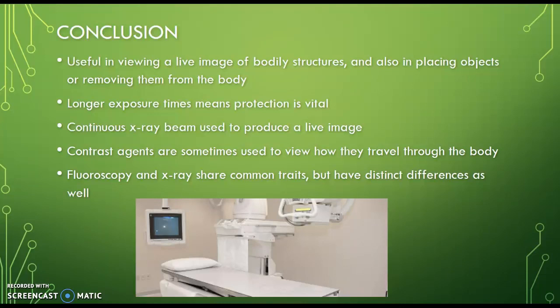Fluoroscopy and X-ray share common traits, such as some of the components included in the machinery, but they also have distinct differences, such as their functions, capabilities, and how the machines are put together.